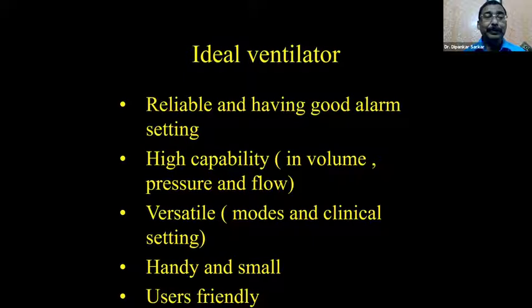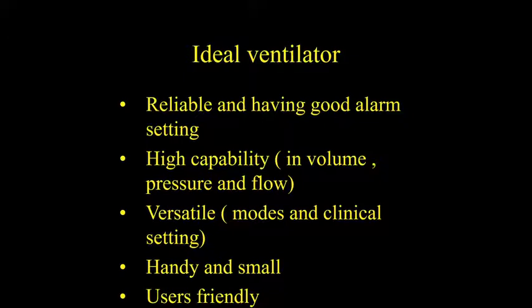So what should be an ideal ventilator? What is the advantage of ventilators? They do not talk. We only talk, and the ventilators only hear our orders. So it should be reliable, having good alarm settings. At least the ventilator should talk. What I have told, the ventilator does not talk; that makes a yes man, but that does not make a good man. So we want a ventilator that talks. And how does the ventilator talk? The ventilator talks through alarms. When the alarm goes off, the ventilator is talking: please come, take care of me.